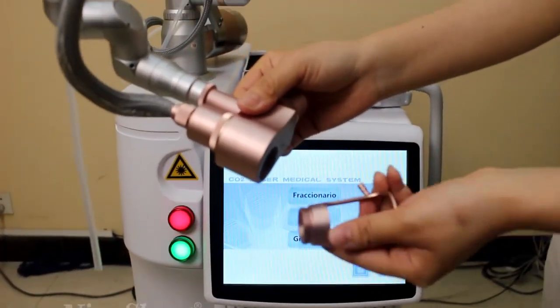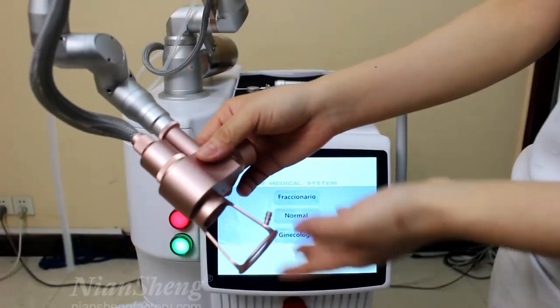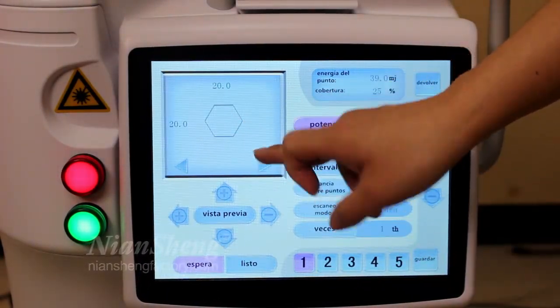Now let me introduce how to install this rod. You can see it's very easy to install the rod. Different treatment shapes to choose.